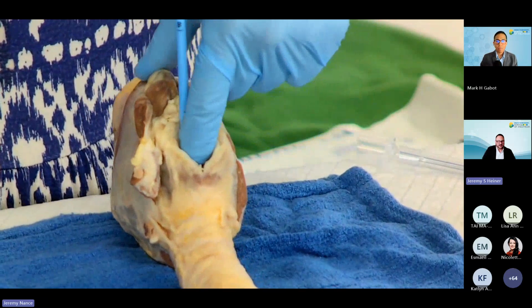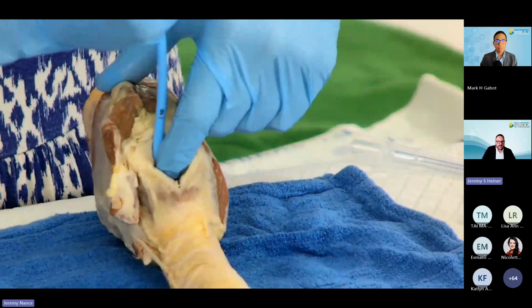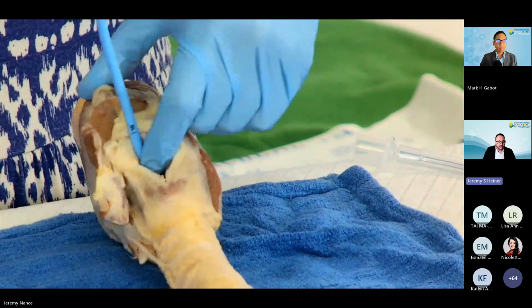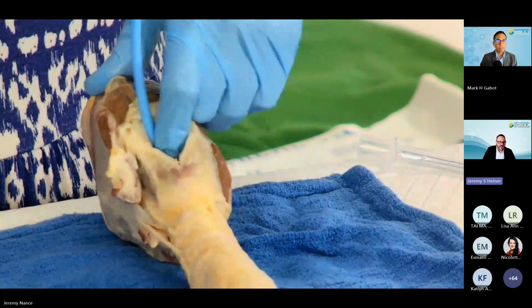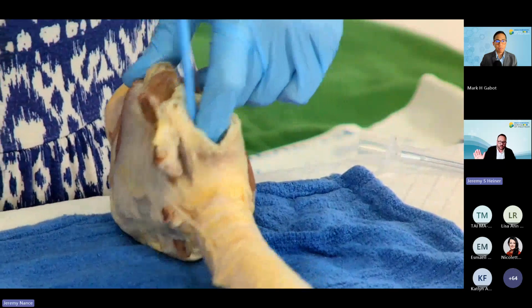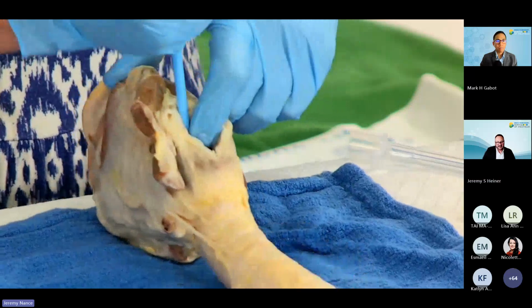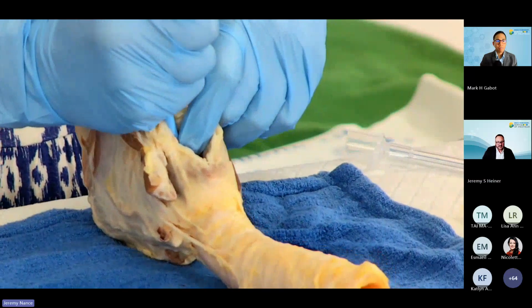Now that helps facilitate the movement of the bougie into the trachea. And there you go. You can angulate the bougie and rotate it towards the patient's face. Just keep pushing. You're fine. Just keep pushing.